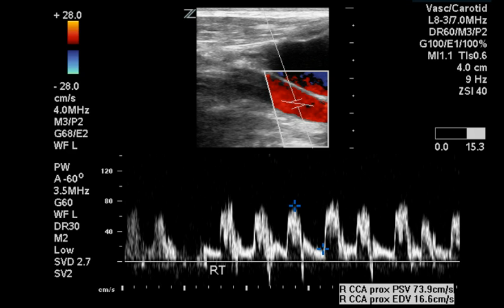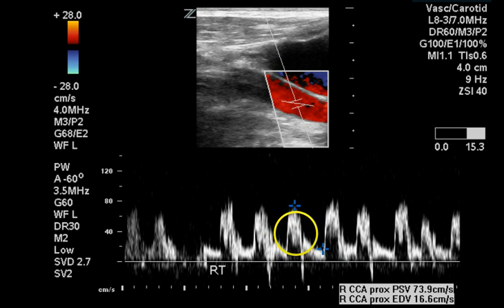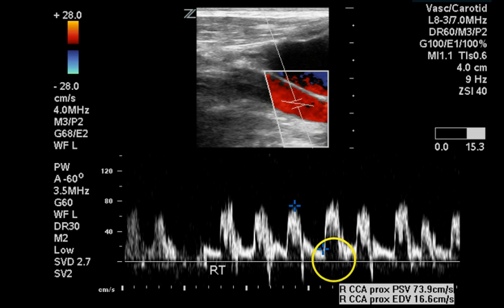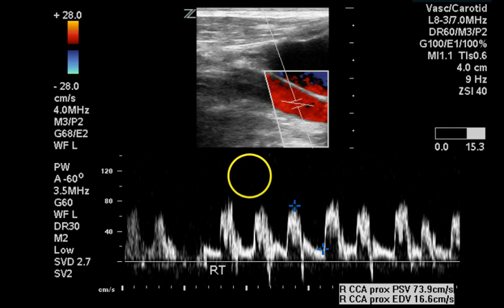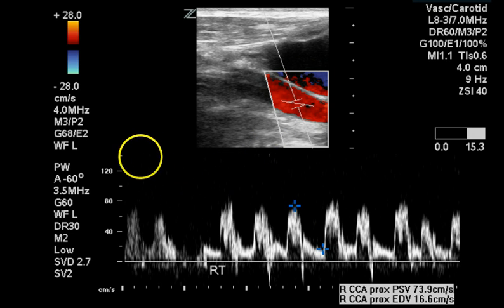This is a Doppler waveform from the proximal common carotid artery. We see a relatively normal-looking waveform with a good spectral window, a fairly deep dicrotic notch, and a fairly rapid heart rate. The angle here appears to be adjusted incorrectly — this appears to be more like a 50-degree Doppler angle or even 45 degrees, rather than 60.